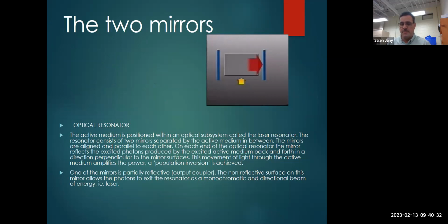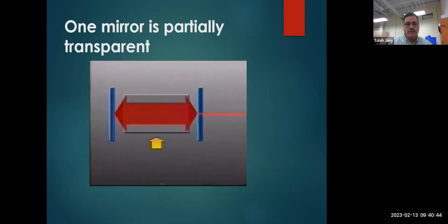But when you stimulate that, it will be stimulated by different atoms stimulating each other. We will have light amplification. We amplify each other by stimulated emission, right? You stimulate the emission of each one until we get the final radiation.